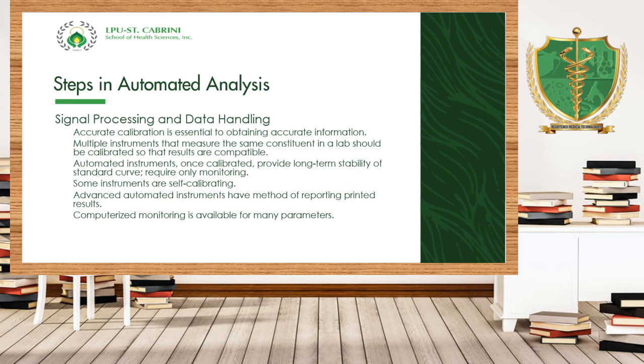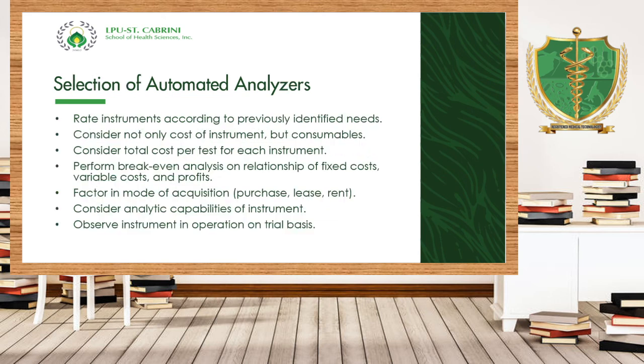Okay. Advanced automated instruments have method of reporting printed results. Ito na yung sinasabi ko sa inyo. Instead na magdi-display lang siya sa screen, isusulat mo, or you will have the thermal paper, meron ka ng printed results provided by your machine. And computerized monitoring is available for many parameters, like for example the use of laboratory information system.